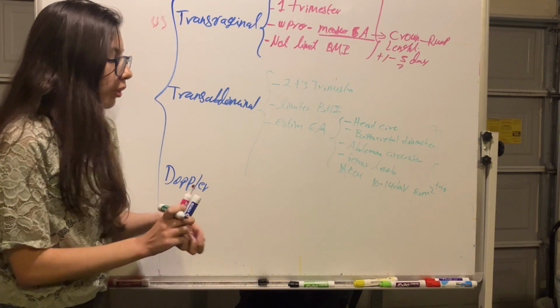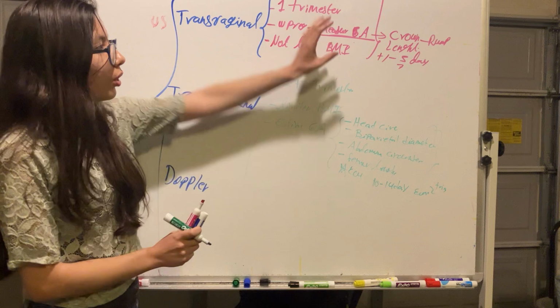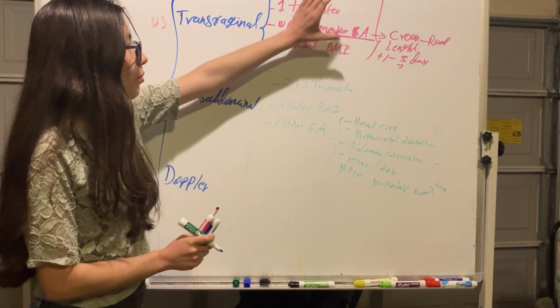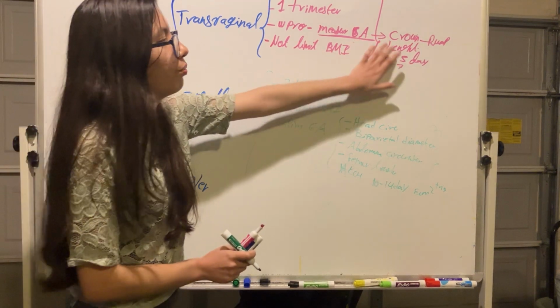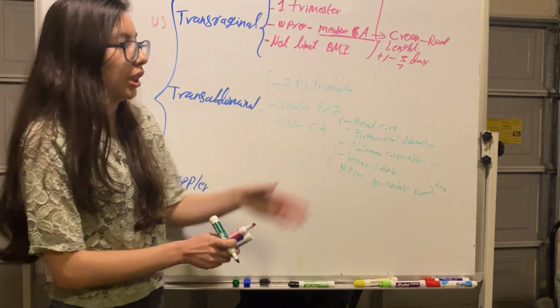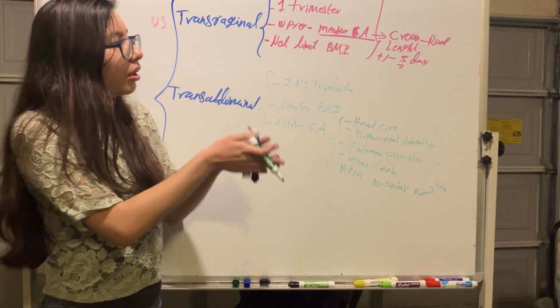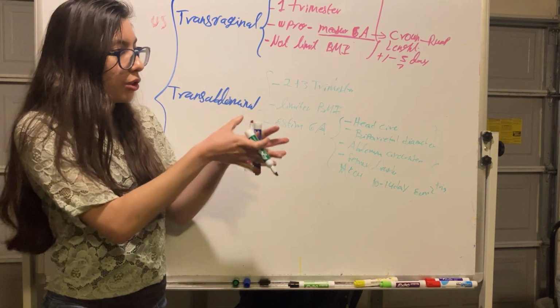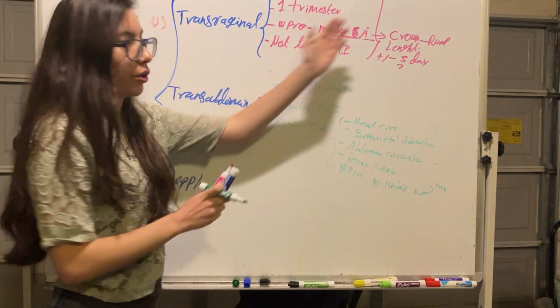But normally the woman presents to the clinic during the first trimester. At this time we do a transvaginal ultrasound measuring crown rump length to estimate how many weeks gestation this patient is at this time, and that measure is what we're going to use for gestational age.